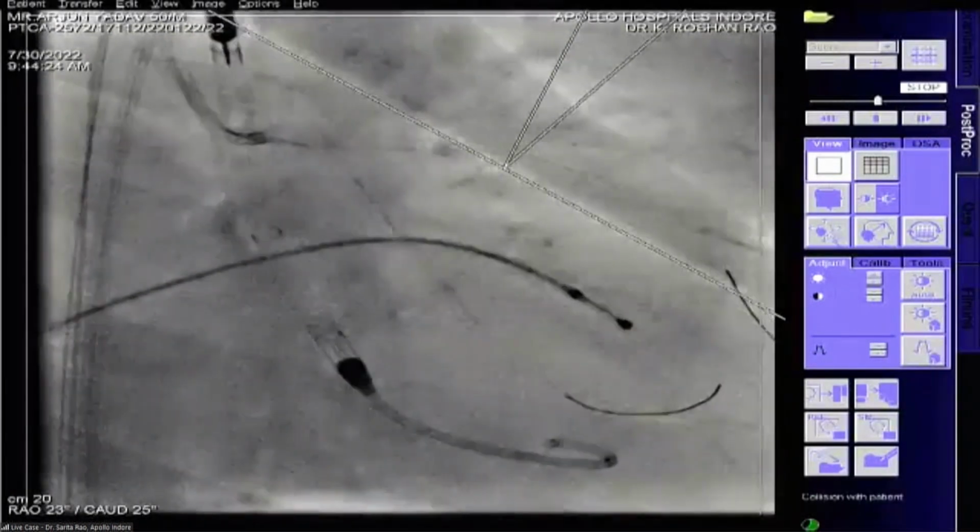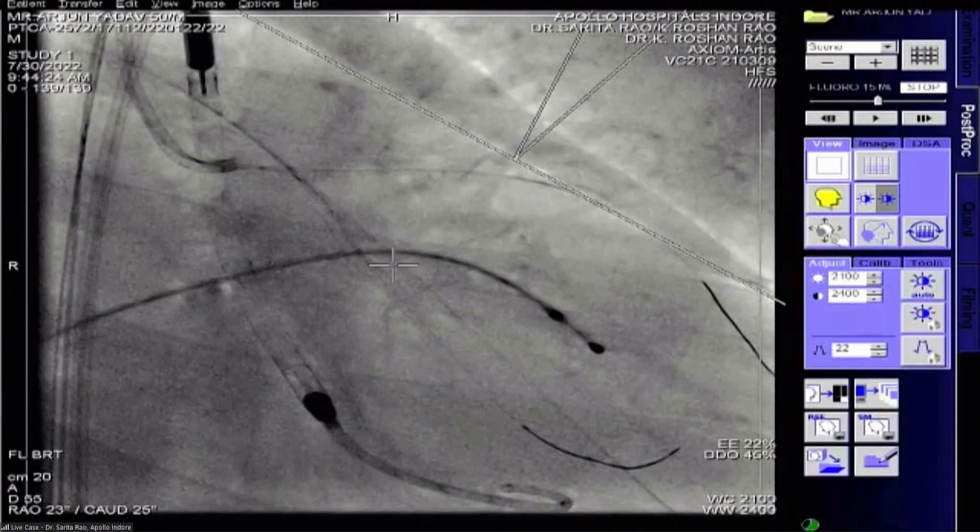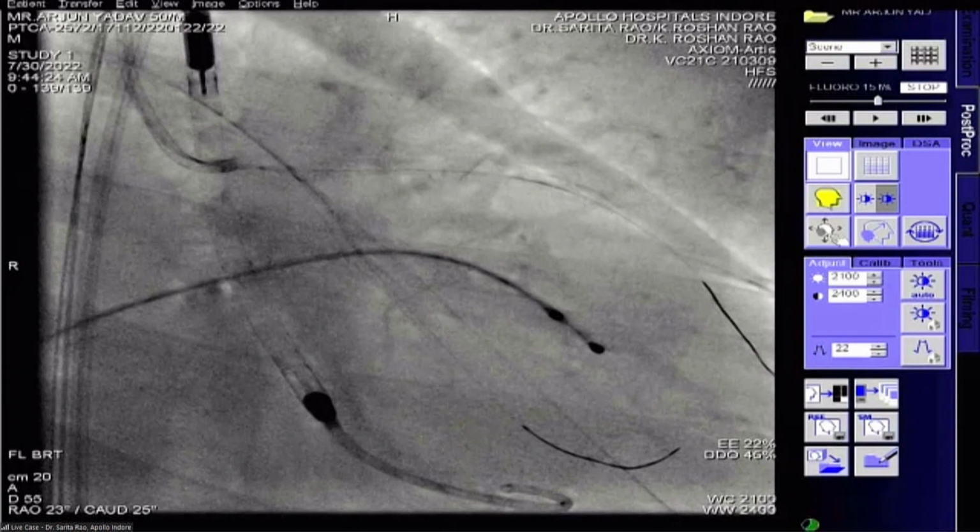So what is generally recommended is to go up to the proximal portion of the origin of the LCX. Don't cross it, because again plaque shift can happen. If you do the proximal portion, then it gets optimized there. I think that's what she tried to do. We'll see the final picture when you do it. Excellent, a great job of demonstration.